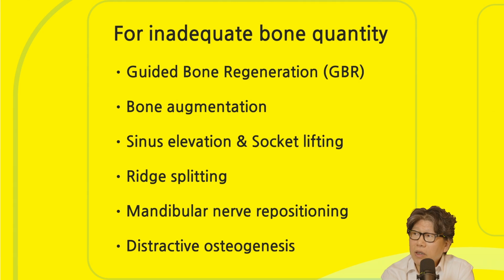It's called DO. I've done a few cases of distractive osteogenesis, but I don't do it anymore because it's too traumatic.